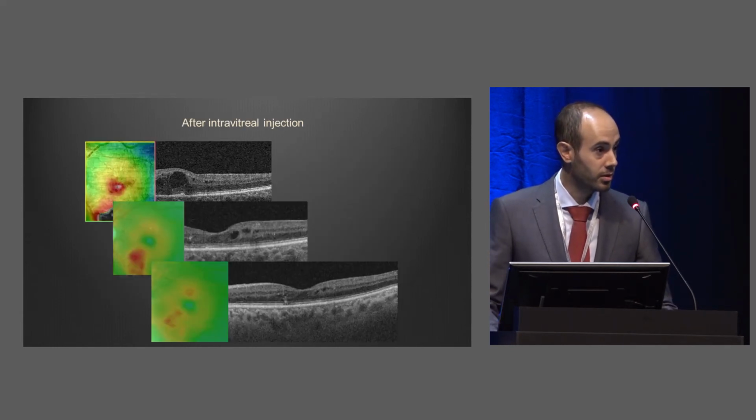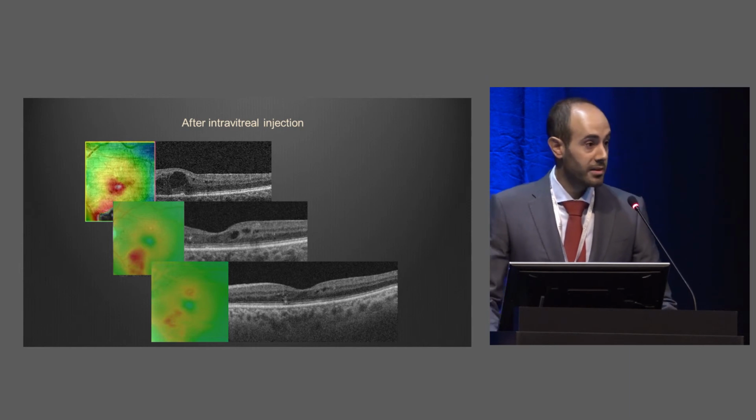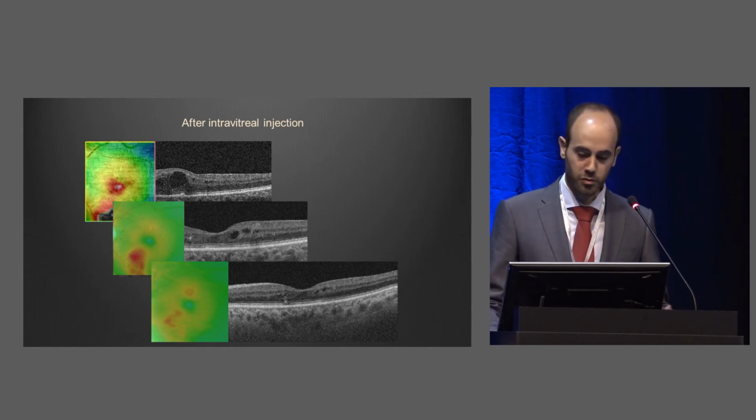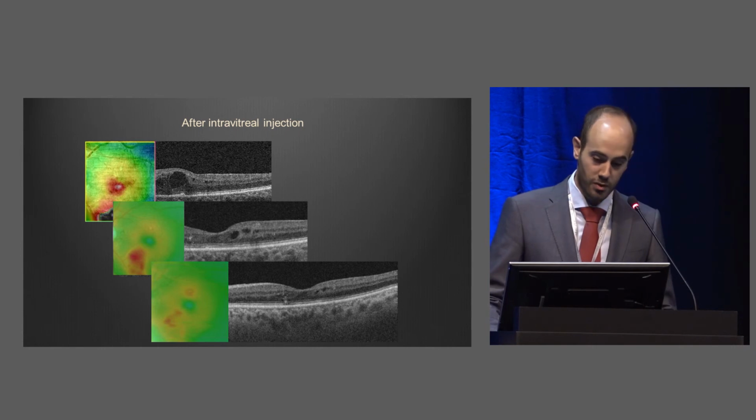Finally, third scenario, combined treatment, consolidation treatment. When you have a fovea deeply involved, deeply bathed in this inflammatory soup, you don't want to perform a laser and wait for 3 months for it to work, because as we know, the longer the photoreceptors spend bathed in that fluid, the poorer is the visual recovery.